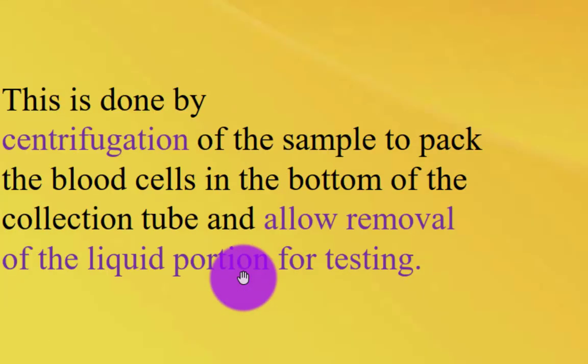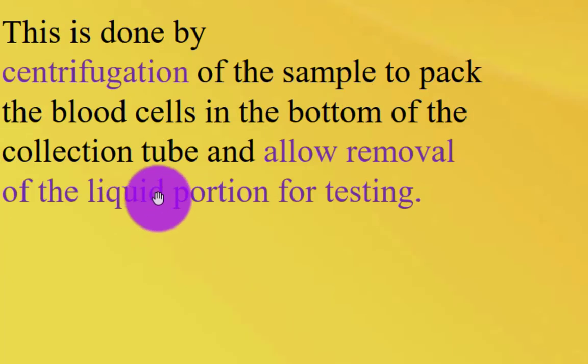This is done by centrifugation of the sample to pack the blood cells in the bottom of the collection tube and allow removal of the liquid portion for testing.